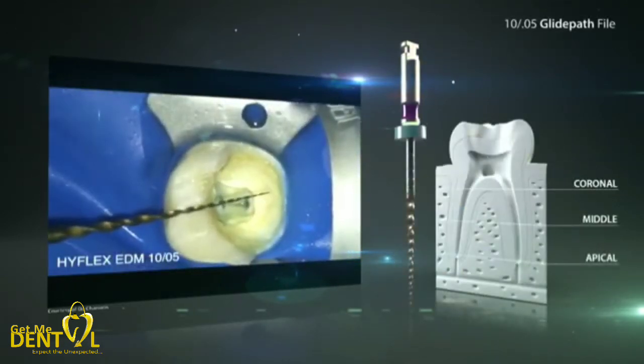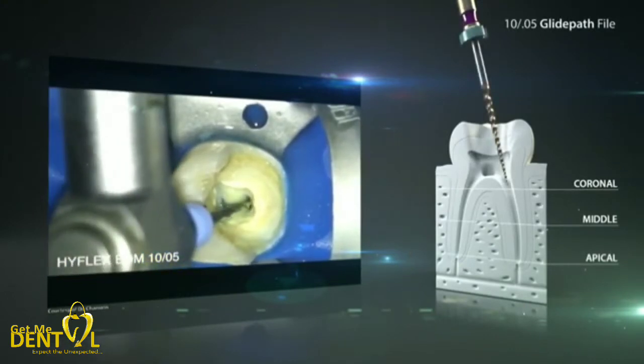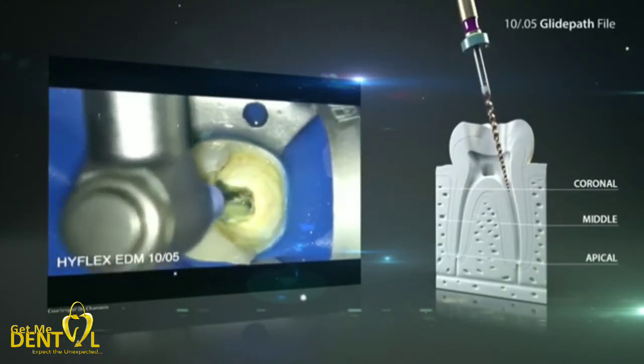The root canals in this case are slightly curved, so after creating the manual glide path initially, a rotating glide path will be created. For this, all root canals are prepared with the HyFlex EDM glide path file.